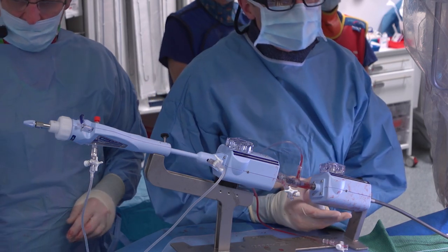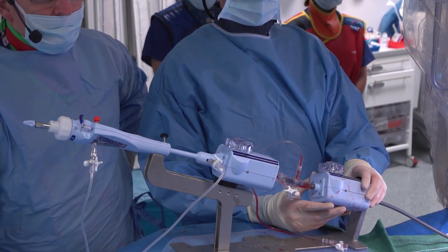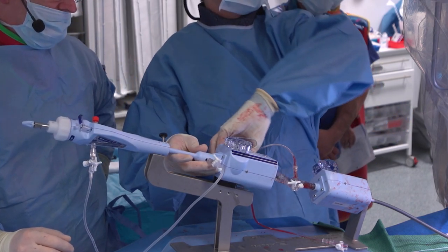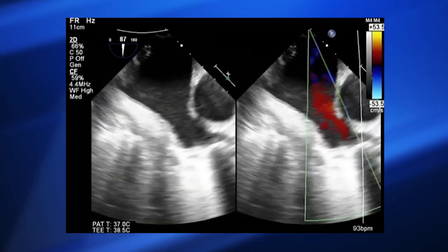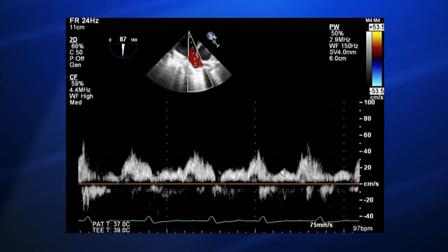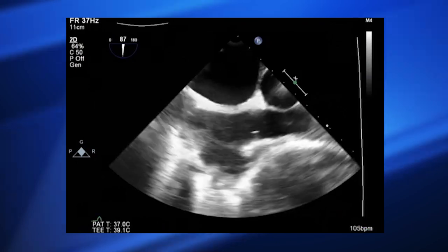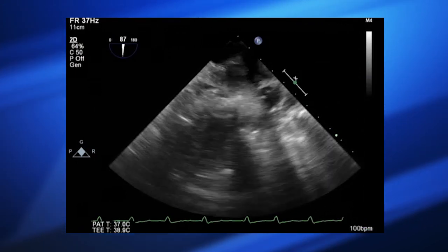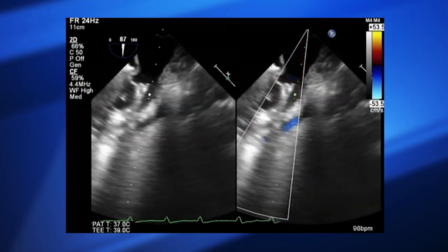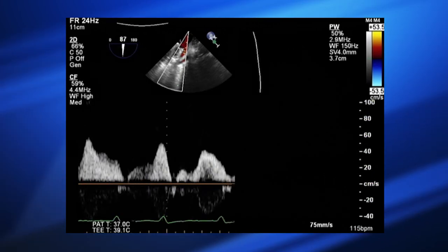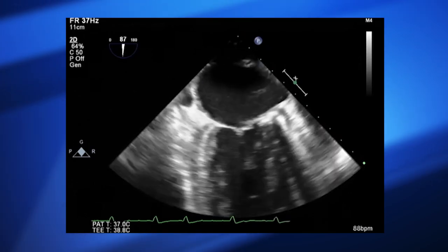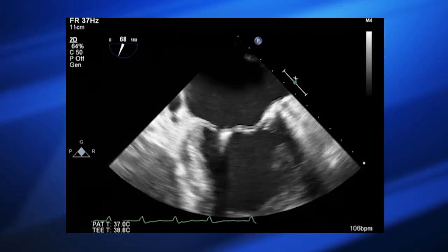We'll just check how much guide we have across the septum — there's plenty. I'm undoing all those movements and getting this clip delivery system out, taking off the M knob and removing the posterior torque. Looking at pulmonary vein flow — this is the right upper pulmonary vein on colour Doppler, and the key thing is how much forward flow there is in systole. We've got a clear S-wave appearing. Coming to the left upper pulmonary vein it's even better — again in systole there's good brisk red forward flow, and a nice S-wave on pulmonary vein Doppler. We've dramatically improved the pulmonary vein Doppler.